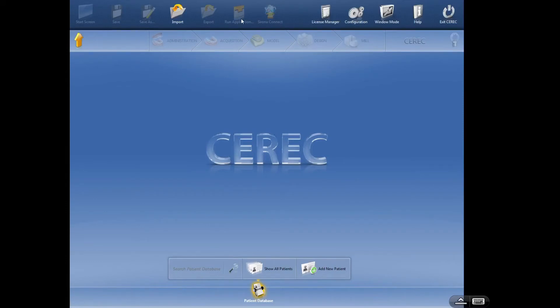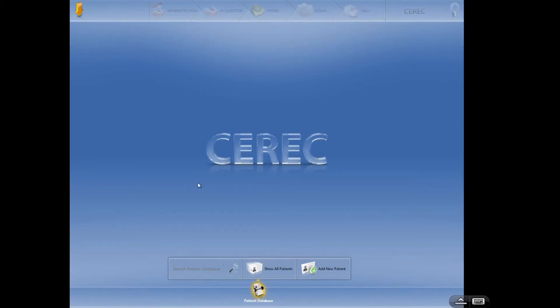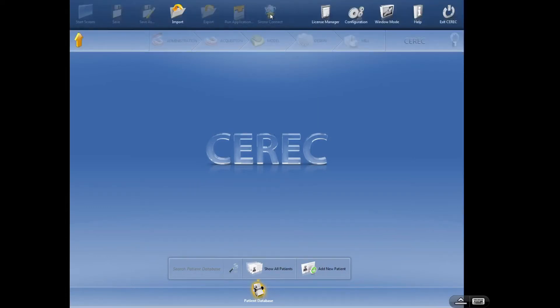I never use Run Application — this is designed to be used in conjunction with other software programs. Sirona Connect is a great feature. We can now export at any point to Sirona Connect. So if you get into a case and you feel like this is above you or something you can't do, you can export it — just click Sirona Connect right there. It'll automatically open the Sirona Connect profile and you can send the case out to a lab that may have different materials available, like zirconia, or just someone with a little more experience.